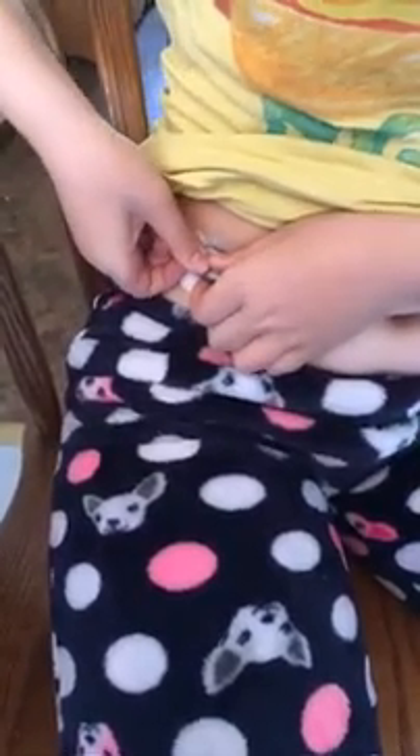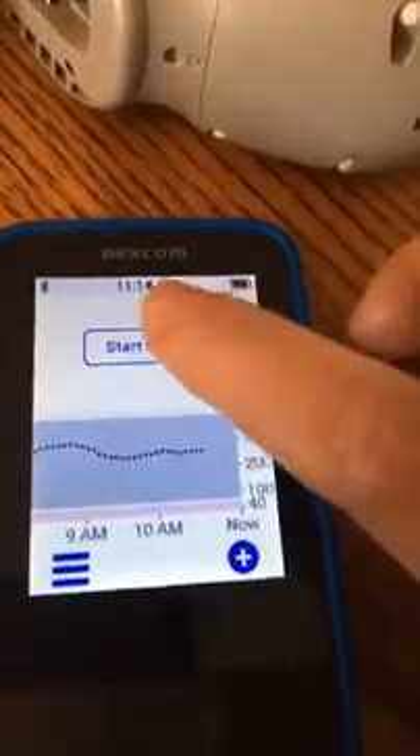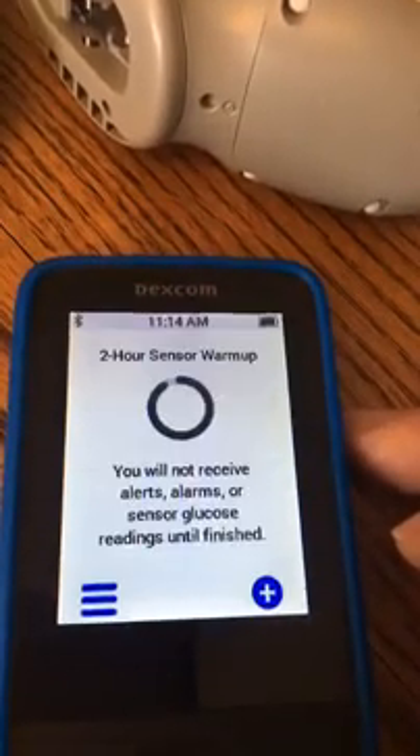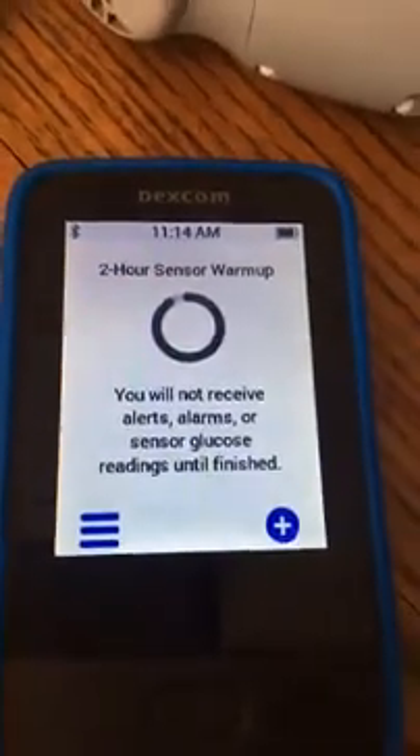So where are we going to do the iPort? Let's do the other arm. We're going to snap the transmitter in there — you just push it in, click it. Then we look at our phone: insert, attach the transmitter, next, start sensor. Now we put the sticky overpatch on. We have a two-hour warmup, so we'll need to do finger pokes if we do any correction or dosing for a meal. At the end of two hours, we'll be up and running with the number.